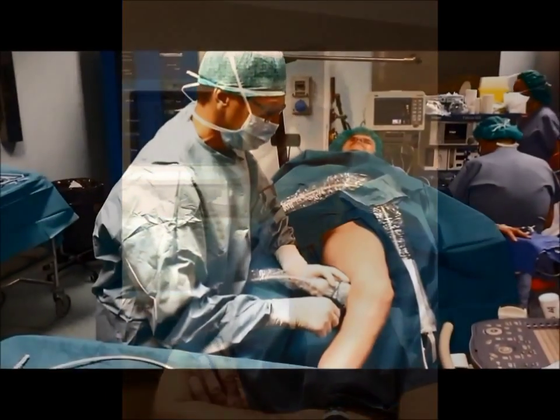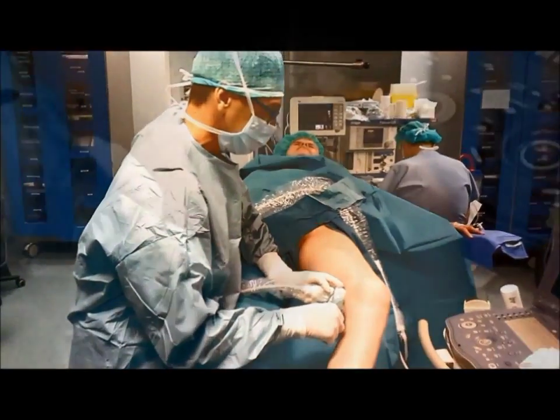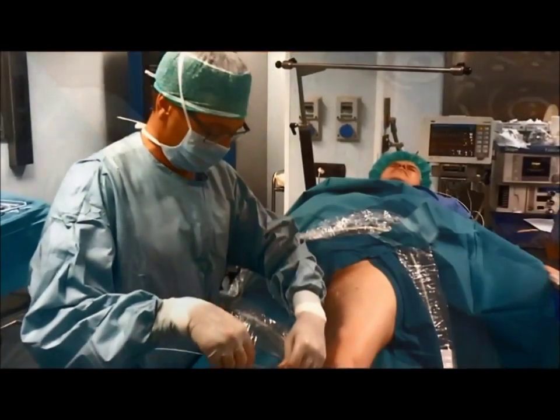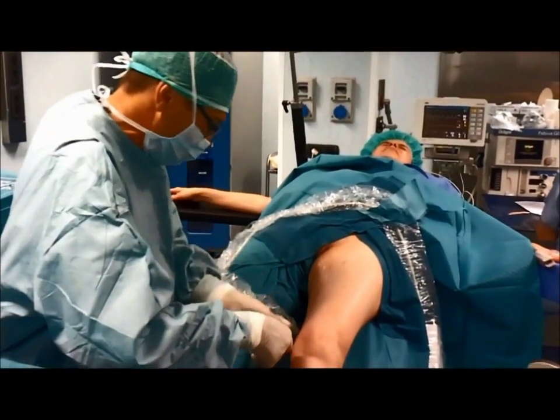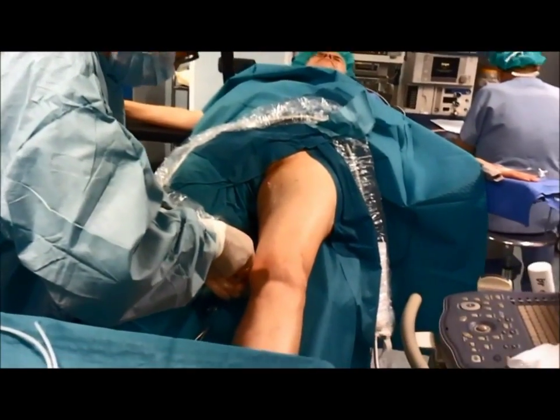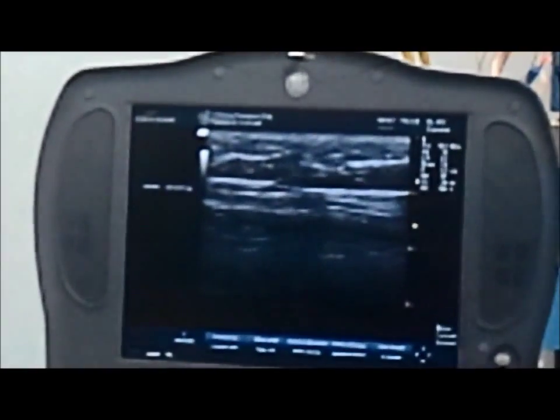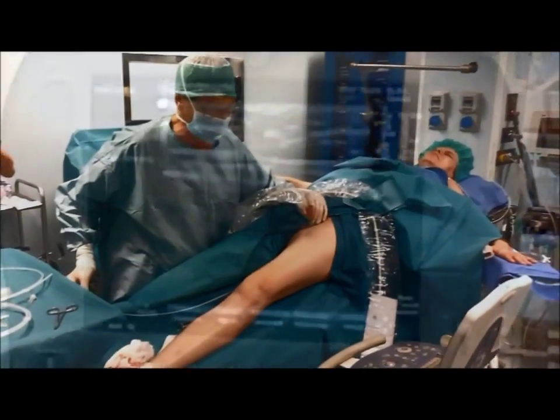The procedure is safe and effective with an occlusion rate at 12 months of over 90%. After having entered the saphenous vein by ultrasound-guided percutaneous access, the introducer sheath is advanced to the sapheno-femoral junction and the catheter is positioned approximately 5 cm below the sapheno-femoral junction.